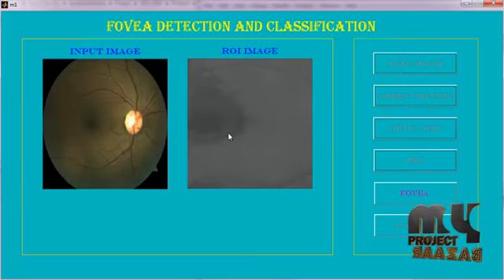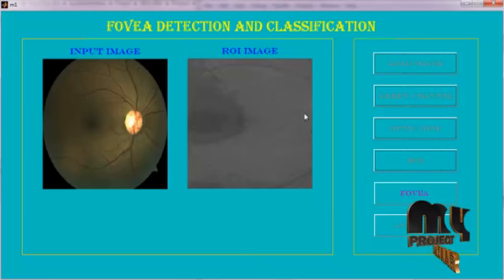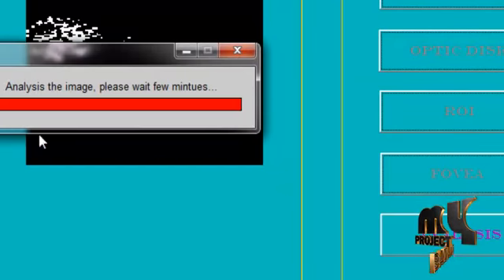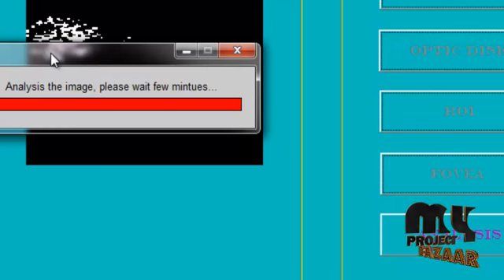Then we go to the ROI or region of interest. We go nearest to the fovea. And then we detect the fovea from the ROI image. It is the fovea. Then analyze that fovea to check if it is affected at normal level or moderate level or severe level. Then we go to the analyze process. It takes a few minutes for analyzing the image. The waiting bar will be opened. And then the given image is normal.